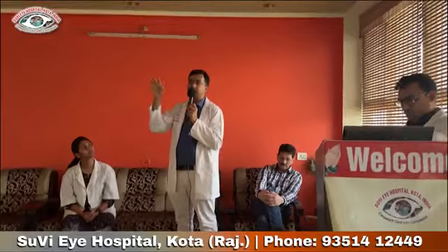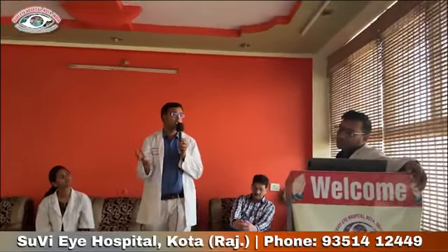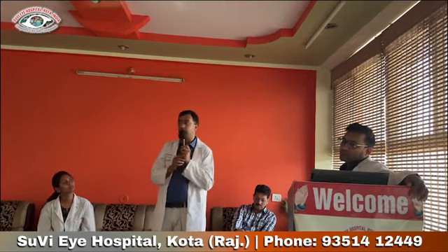If one eye has peripheral retinal hemorrhage, ask for a history of stroke or any cardiac history, and consider ocular ischemic syndrome. So what we do is an FFA to delineate the capillary non-perfusion areas and do the PRP there as a prophylactic PRP, so that new vessels or bleeding do not happen.